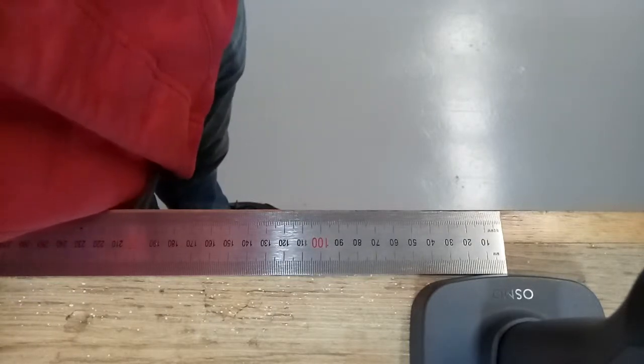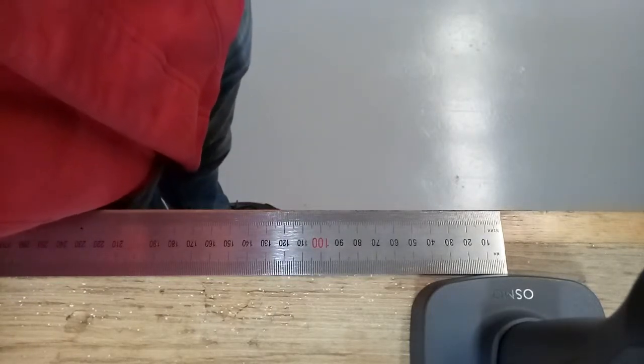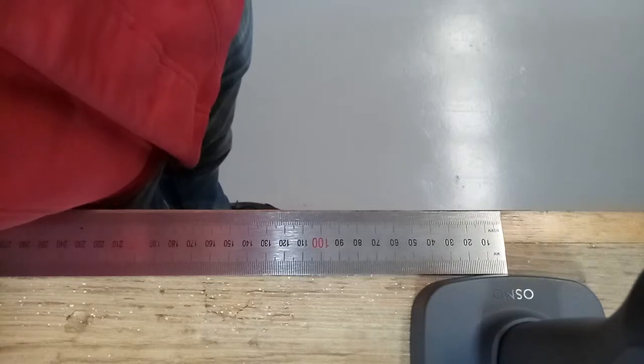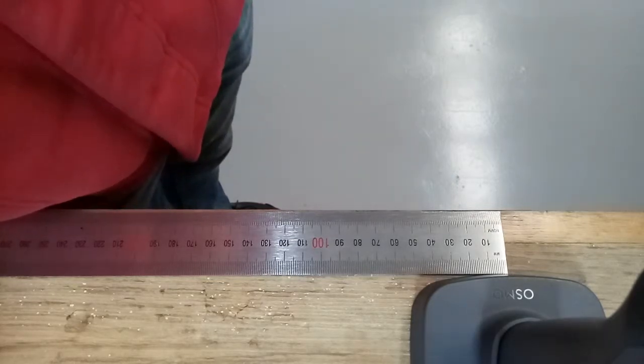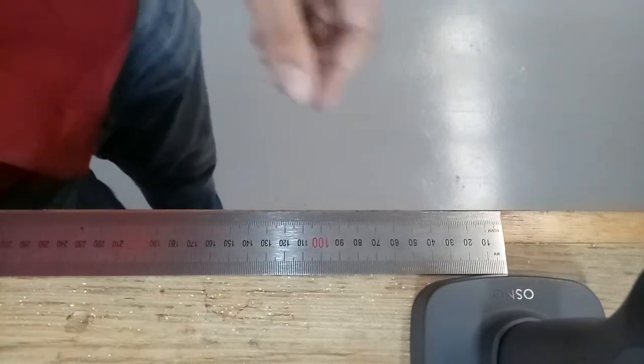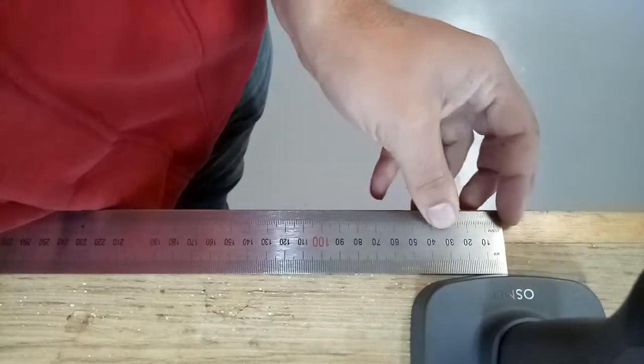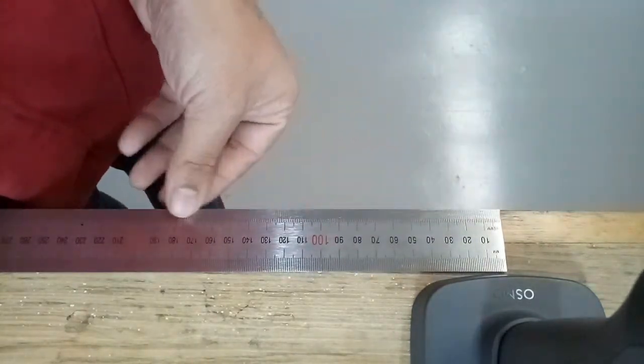This is an instructional video for how to take the four photographs needed to make your 3D hand. The first step is to find a ruler and stick it along the edge of a table.